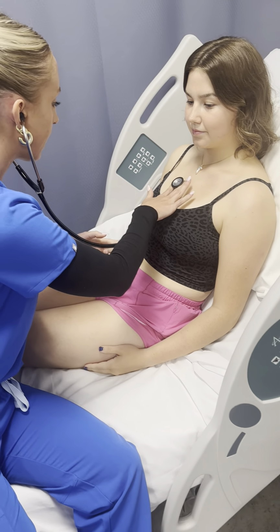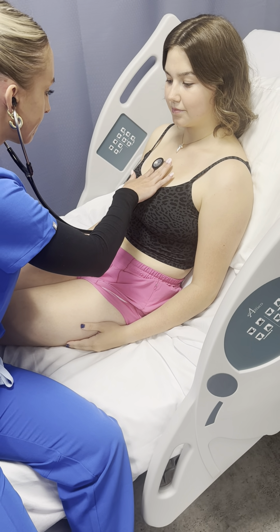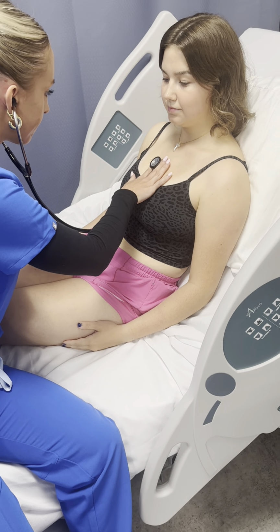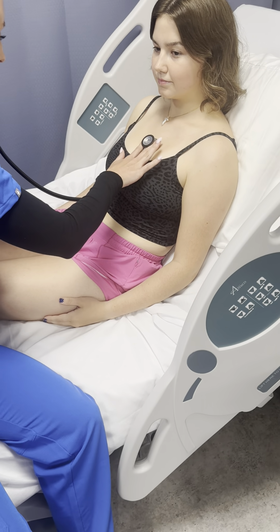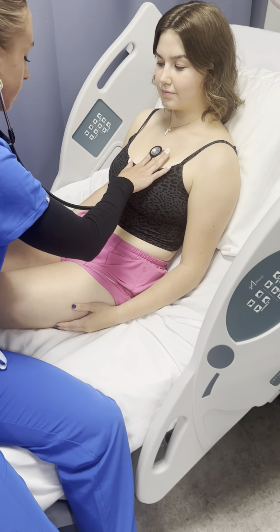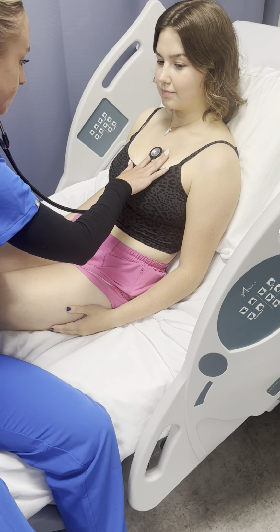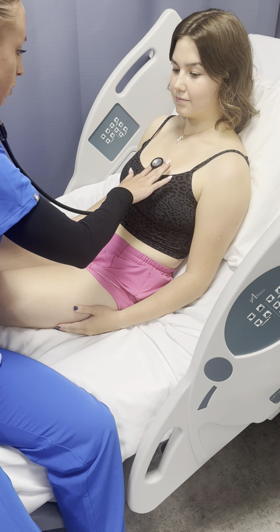I'll listen to the aorta first. And I'm listening to the pulmonary. And I'm listening to Erb's point.